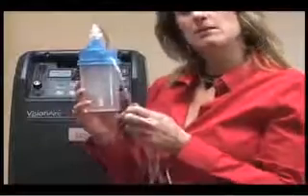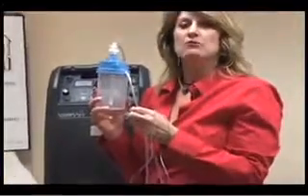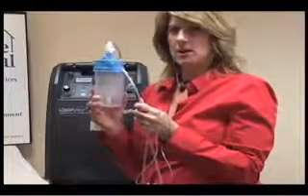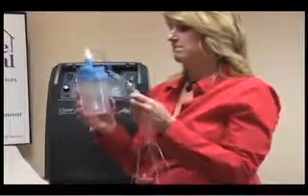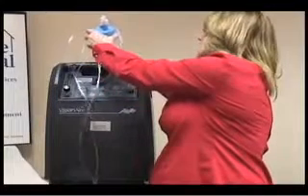You are going to clean the humidifier bottle with warm soapy water every day. Rinse it out. You can also disinfect with 3 parts water to 1 part vinegar and replace it with new distilled water every day. The humidifier bottle gets placed in a holder on the back of the machine.